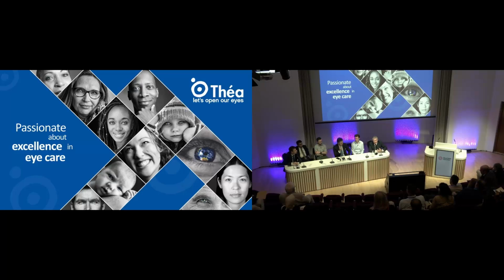So even though you get PROMs that are satisfactory, it is not an ideal optical solution. And the beautiful thing of cataract surgery after corneal refractive surgery is that you have spherical aberration in the cornea. And if you're on a modern laser, you have it with an eye tracker on the visual axis, which means that you have EDOF in the cornea, which means you can use an SA60 from 1996 and get a brilliant EDOF outcome with a monofocal IOL with low PCO rate, instead of paying like 10 times more for what they call an EDOF lens now, which is actually a lens that is not aspheric, so it induces spherical aberration, which is what the lenses in the 1990s were doing in the first place.